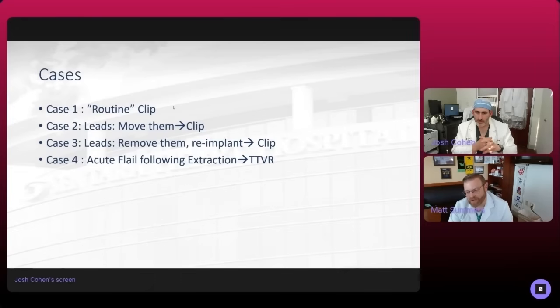I do think there's an escalation in your capabilities and the kind of cases you're willing to take on when you start from the standpoint that this is an imaging-driven procedure. I tell every single patient that you're the eyes and I'm the hands, and it's a two-person operation, because it's very much true. If you don't have a good imager who's also done the pre-imaging and is facile in all of these, the cases you can successfully embark on are an order of magnitude different.